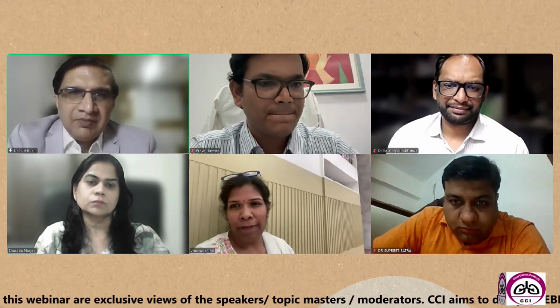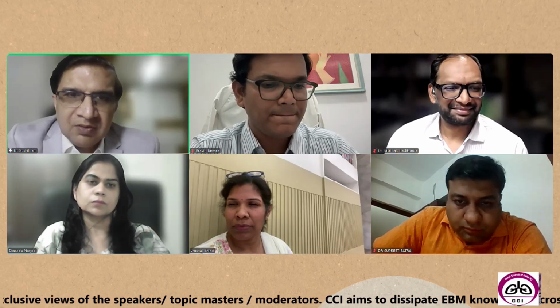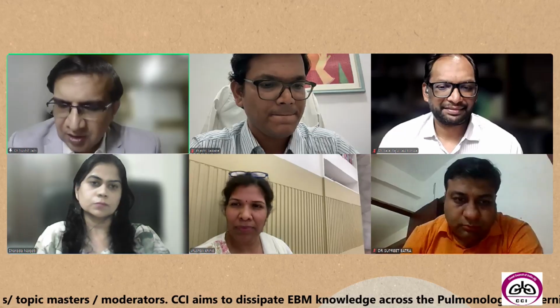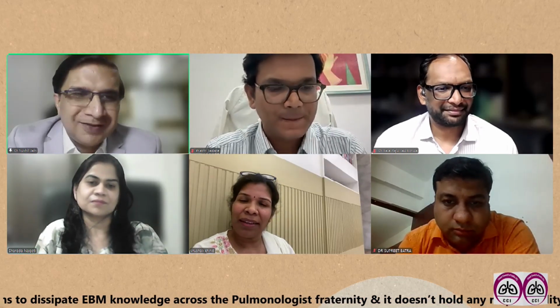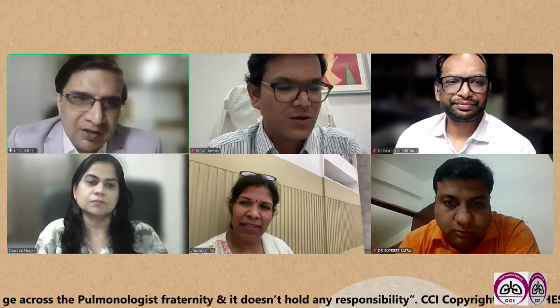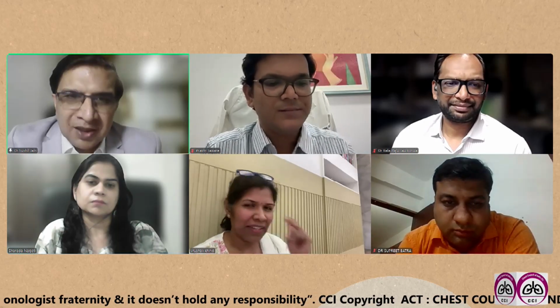Okay, thank you. Maybe if you want a bigger tissue, especially in lymphoma or benign conditions, sometimes we use 19 gauge, but only in very selected situations. Yes, there may be a difference in opinion on that. The problem with the Indian scenario is that your histopathologist a lot of the time asks for a bigger tissue, and we don't have very good histopathologists and cytologists in India. So sometimes, especially when we're suspecting a lymphoma, we try to go by 19 gauge. I know the data may not be very great, but that's what a lot of us do.